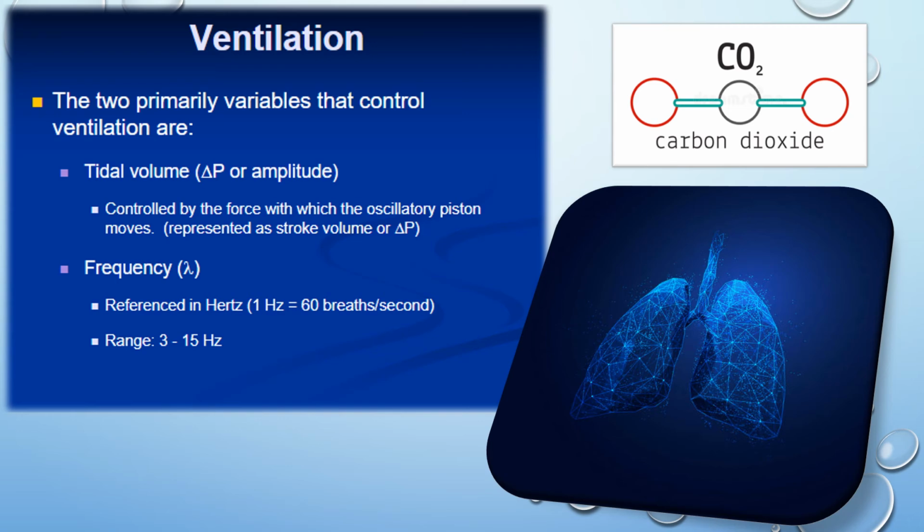There is a resonance frequency of the lungs in which optimal ventilation, through carbon dioxide removal, occurs. Resonance frequency varies based on lung size, the degree of lung injury, amount of lung function, type and extent of the disease state, and the size of the patient. Gas transport becomes dependent on tissue inertia rather than elastance. If there is a disturbance of normal gas flow, VQ mismatch exacerbated by hypoxemia and worsening respiratory acidosis will occur.